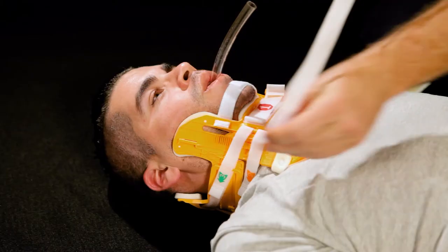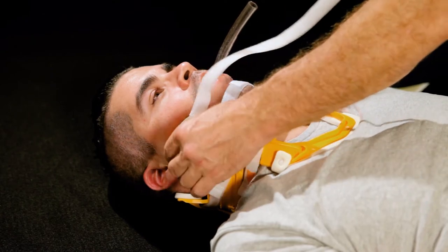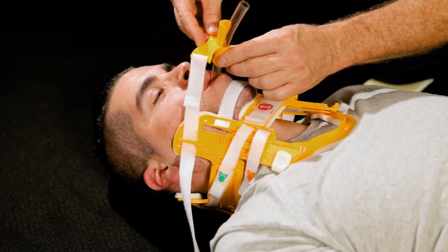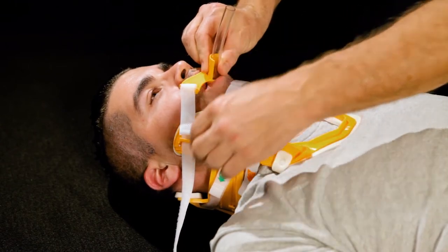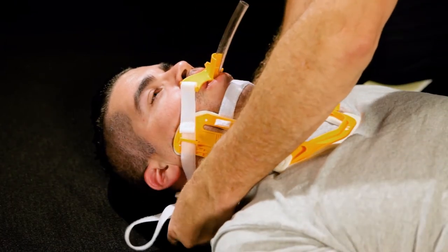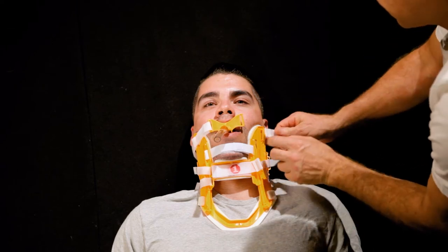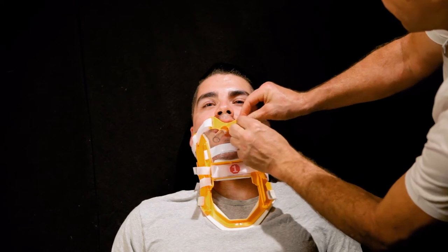Attach one end of the strap to the tube holder and slide the other end through the anchor point. Place the tube holder around the airway tube and slide the bite block into the patient's mouth. Loop the strap around the splint and through the anchor point on the other side, then attach the strap to the tube holder.